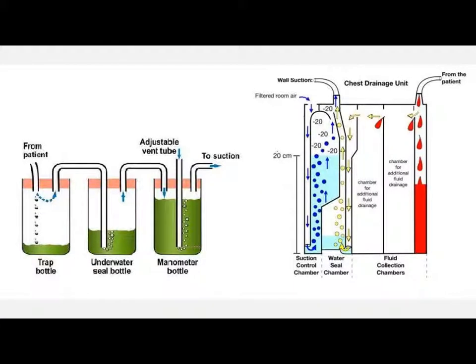This same three-bottle system is conveniently packaged into a single unit, such as the Atrium one we see here.